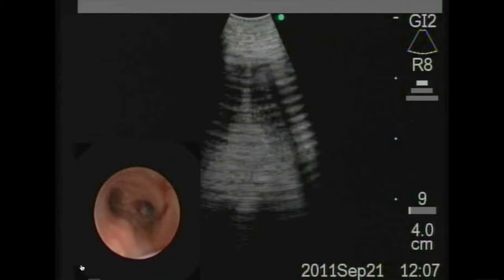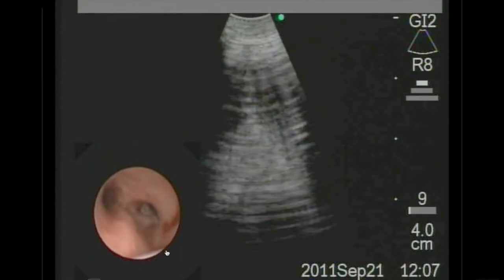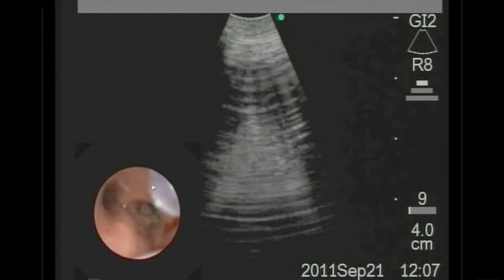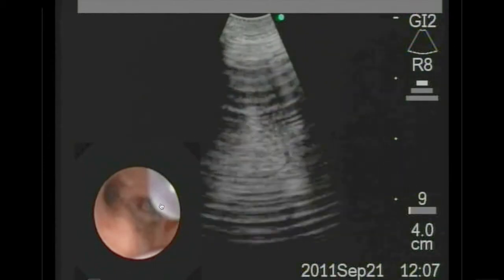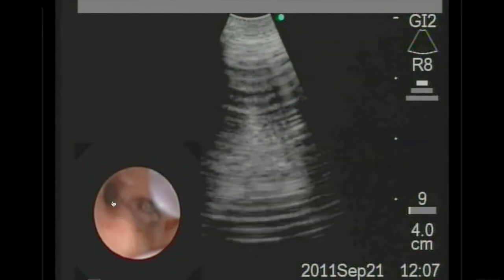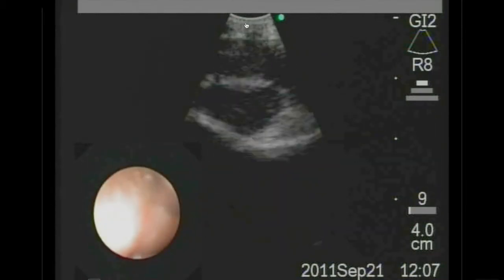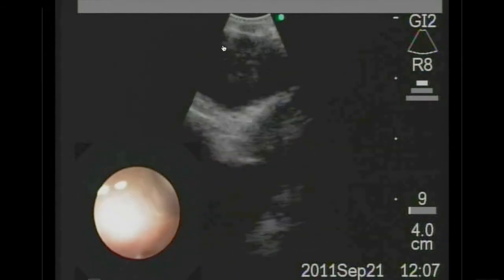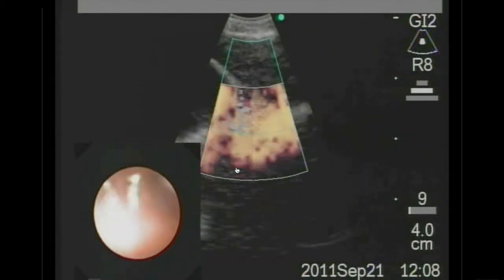Here's the procedure. This is the endobronchial view. You can see a little balloon there that's covering the ultrasound, and this is the ultrasound view. We know that the right paratracheal lymph node is just going to be up here somewhere. This is the sheath of the needle — that just protects the scope from the needle and that's where the needle is going to come out of. So we want to look around here. On the ultrasound we can see this is a blood vessel. Now that's the lymph node we're concerned about.